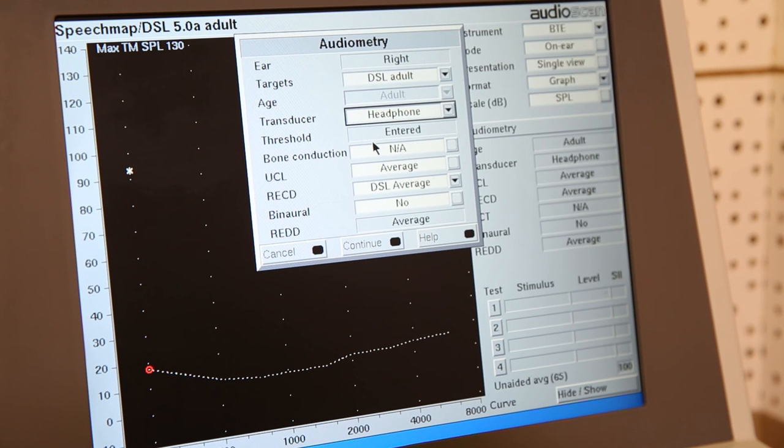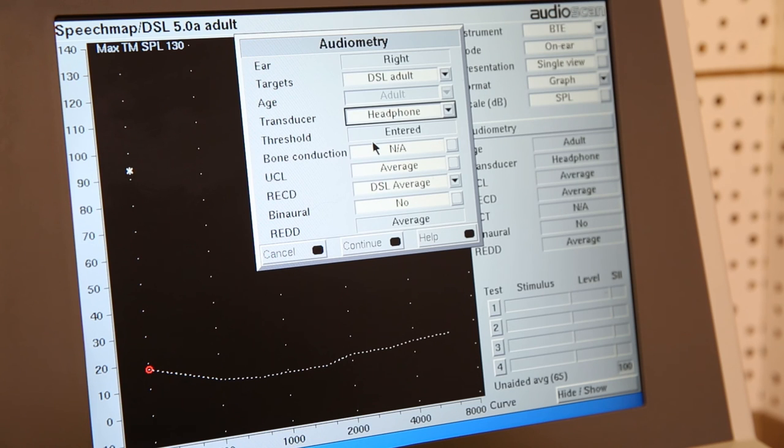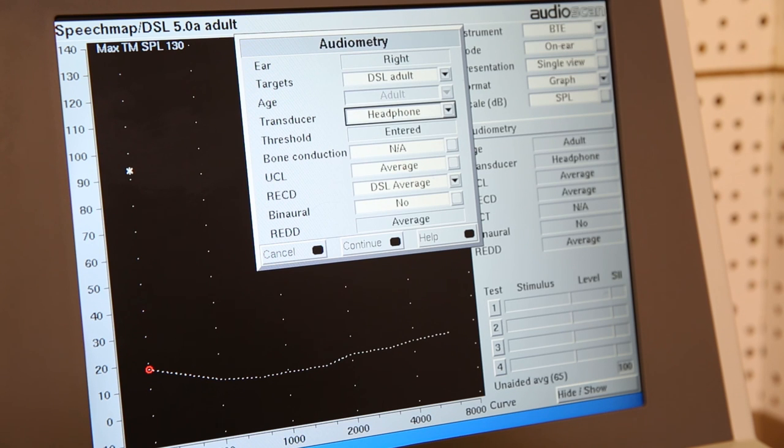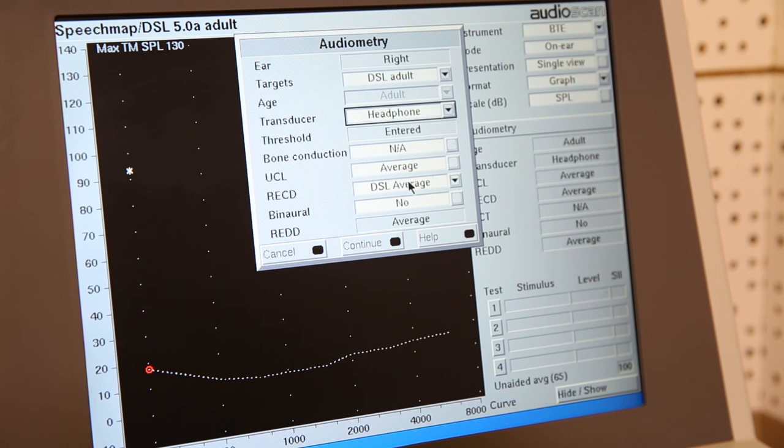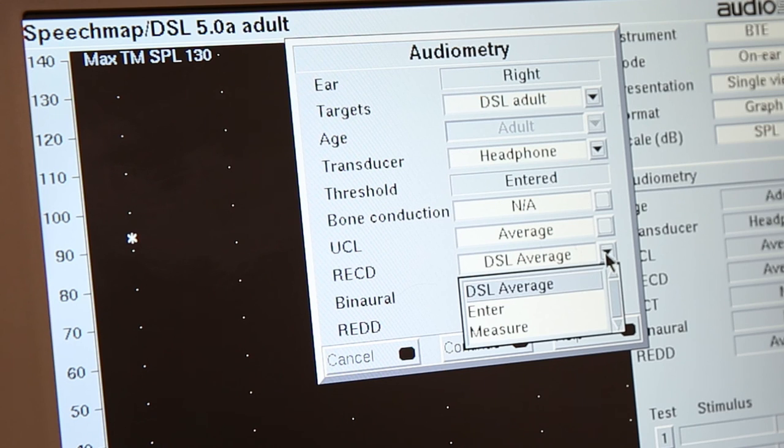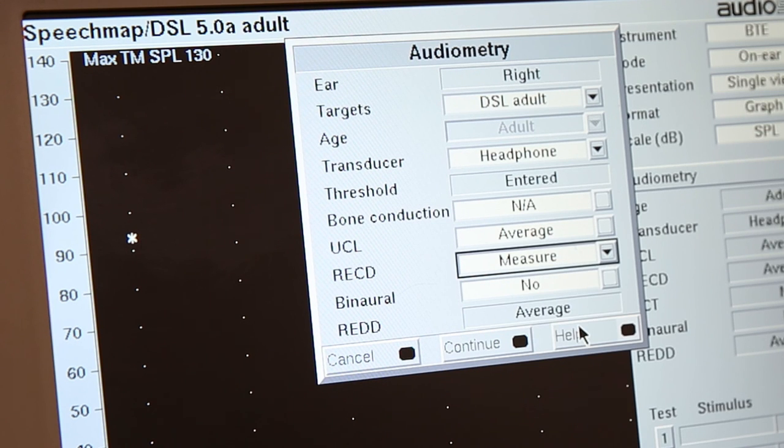So when we verify the fitting, we want to use the client's real ear information to create a target that is more specific to them. In order to do this, we measure the real ear to coupler difference, or RECD, to give us an accurate indication of the client's real ear canal resonance characteristics, versus the 2cc coupler information the hearing aid was most often programmed with. So we will select that we want to measure the RECD over here.